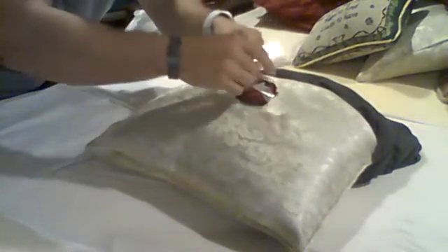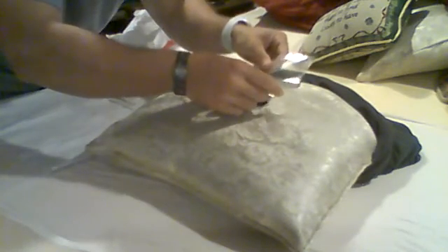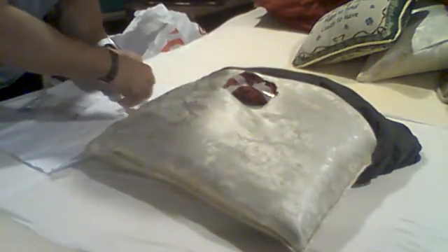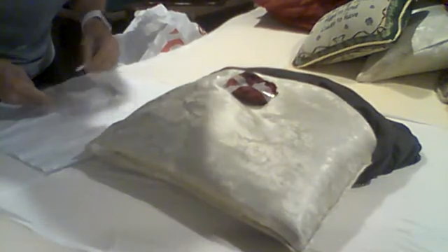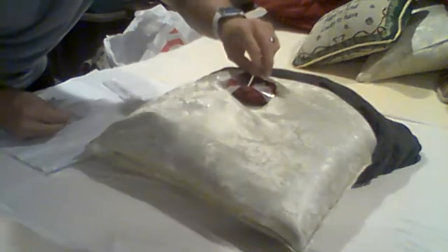So I'm going to go ahead and get the width, the length, and then with a cotton swab, I'm going to do kind of two things. So I want to get the depth of the wound first. Dispose of that. Then I want to check for tunneling.